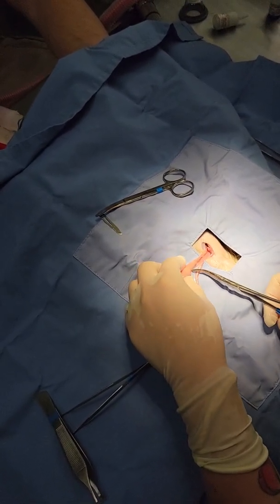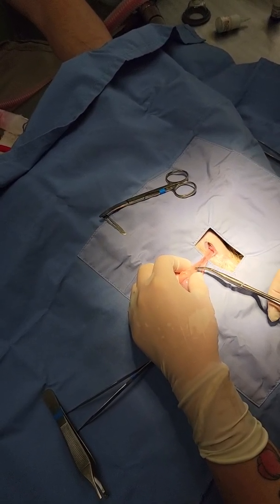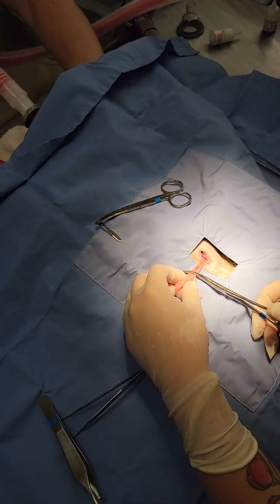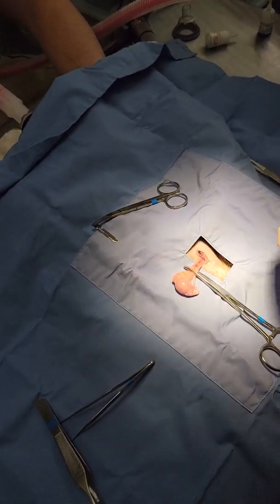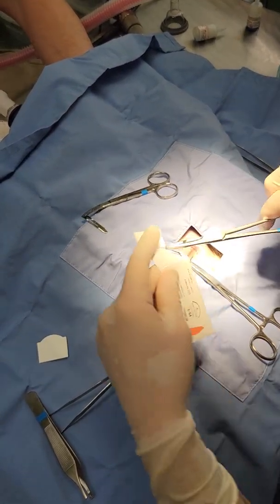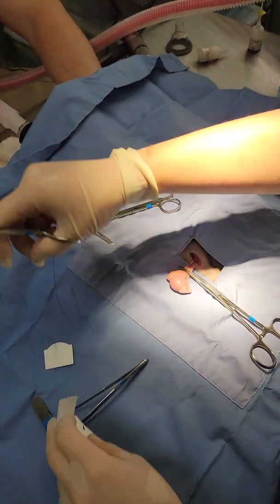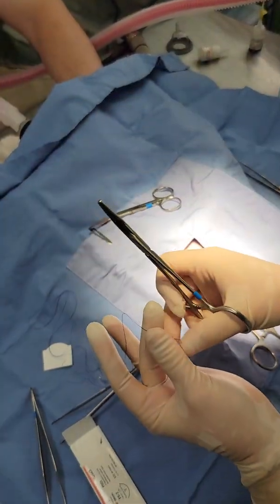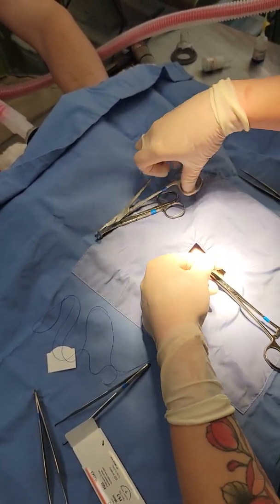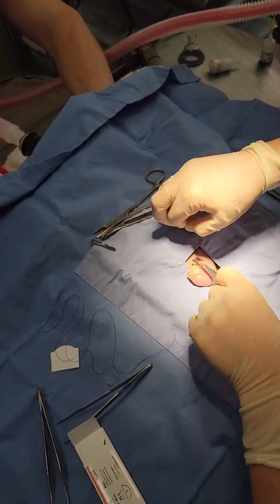So here we have our testicle. You'll notice as these guys get bigger and older they'll put more fat right here with the cremaster muscle as well as the vessel. Here's the ductus. So I'm just going to place my clamp there and I'm going to do two encircling ligatures. I typically do 3-0 monocryl. I like a monofilament for these guys — I especially like monocryl because it tends to break down pretty quickly and doesn't tend to produce inflammatory reactions. I've seen PDS will. So I'm just going to do my two encircling ligatures here. There's one.